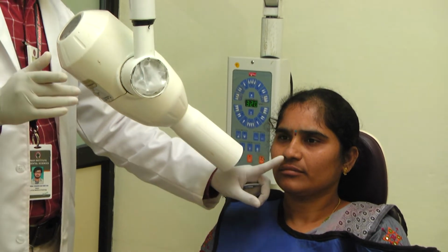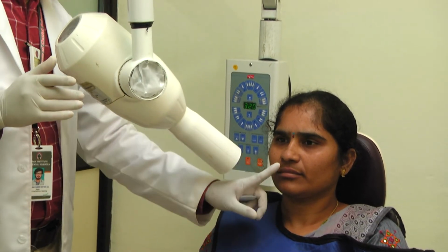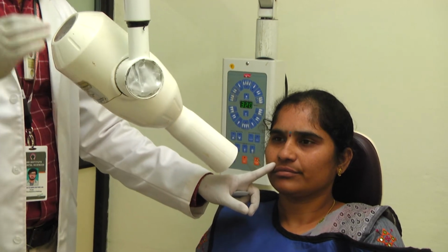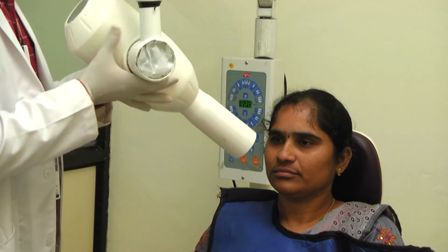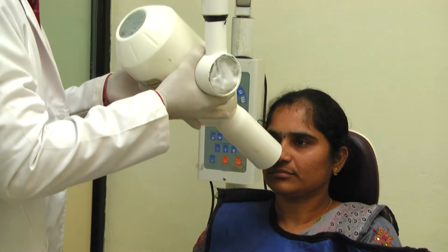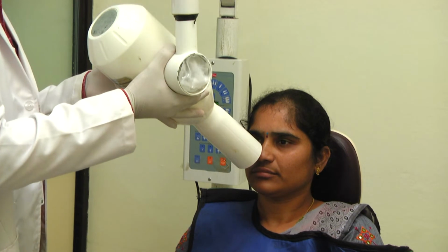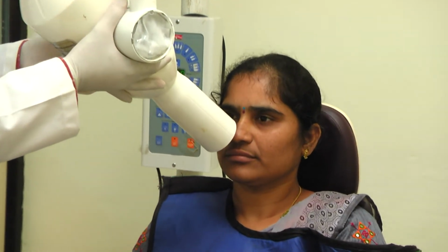I am repeating, just above the upper lip and 1 centimeter from the midline is the point of entry for maxillary lateral incisors.